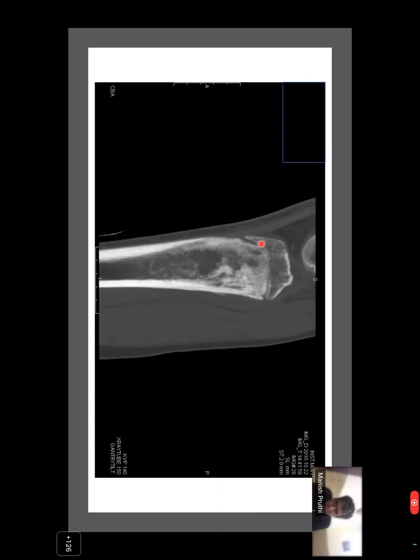The delineation between normal and the lesion is there, sir. I'm able to see the delineation. And as far as the pattern of infiltration, it looks like there's some kind of a moth-eaten pattern. Agree.